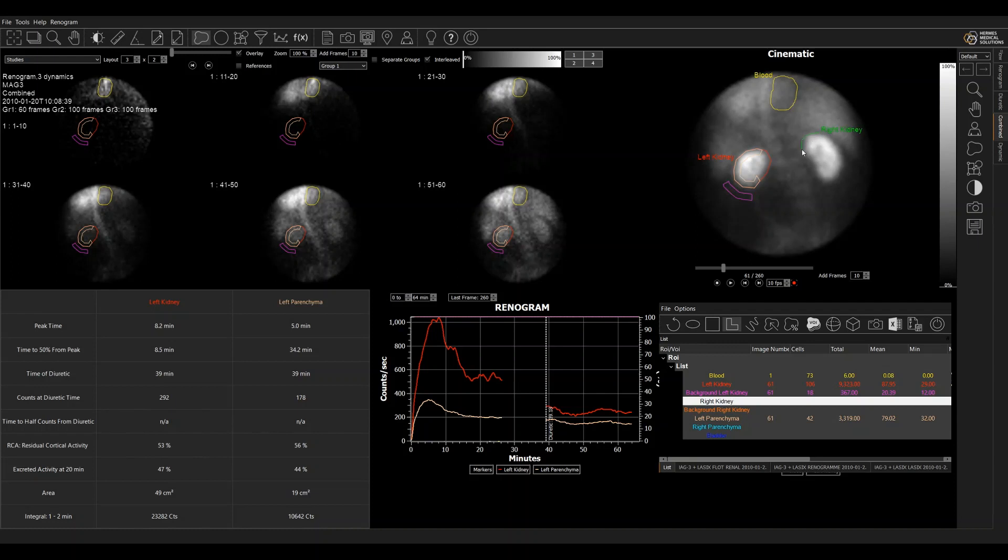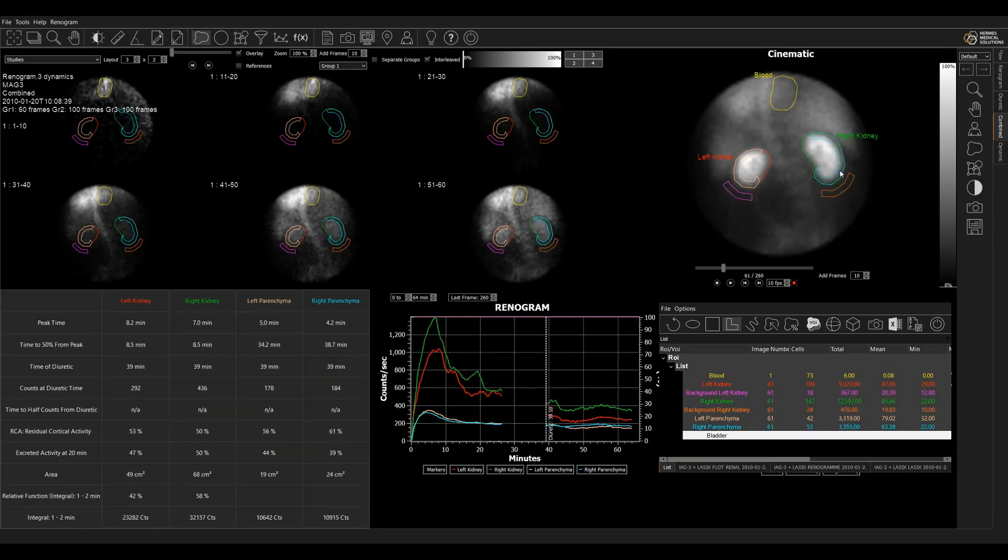Let's move on and draw the right kidney region just like that.